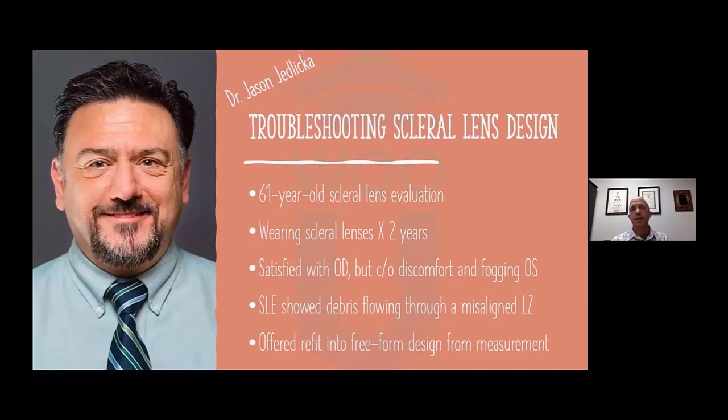For this next case, I'm actually going to use a case from my friend, Dr. Jason Jedlicka, and it's on troubleshooting scleral lens design. And that's going to be a theme here for some of the next cases, where we have patients that maybe are not doing great with their scleral lenses or failed in scleral lenses. And we're going to use measurement from instrumentation to help us sort through that.